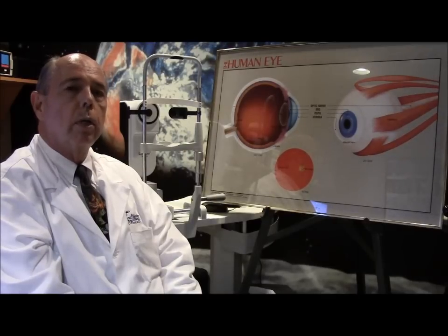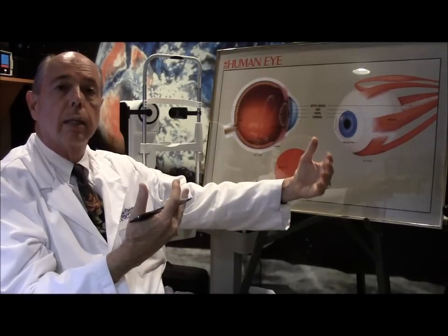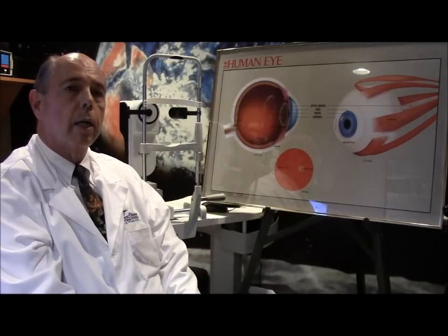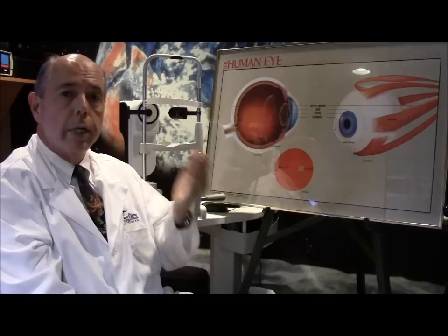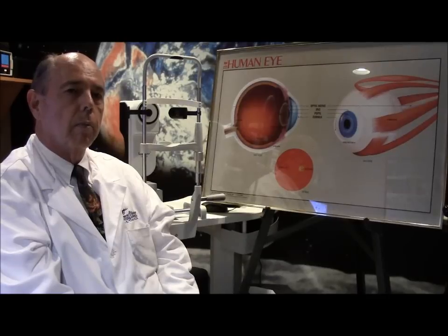A lot of times people want to do monovision — that is, one eye set for distance and one eye for close with their implants, just like they wear contact lenses that way. So we measure which is their dominant eye, because we typically set the non-dominant eye for near and the dominant eye for distance. That's a test we commonly perform.